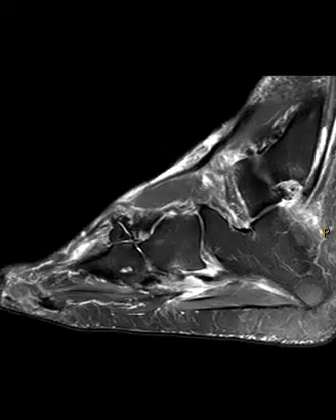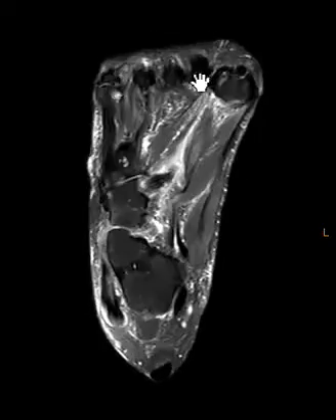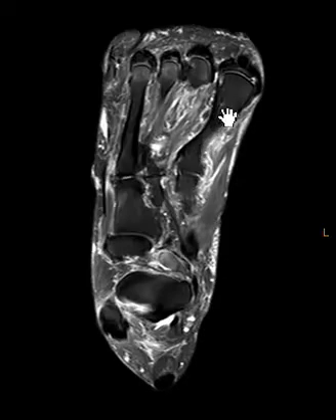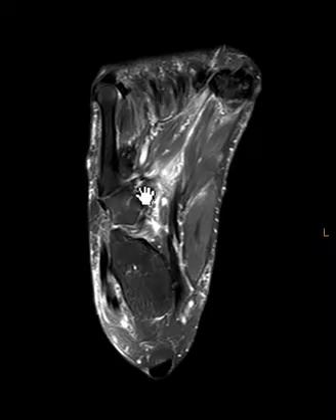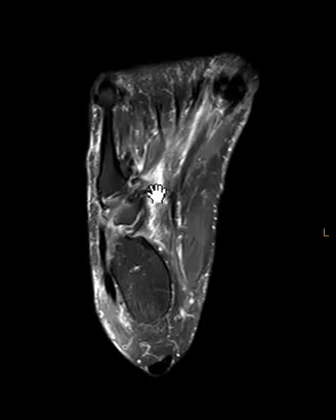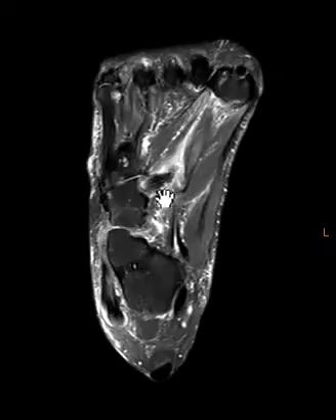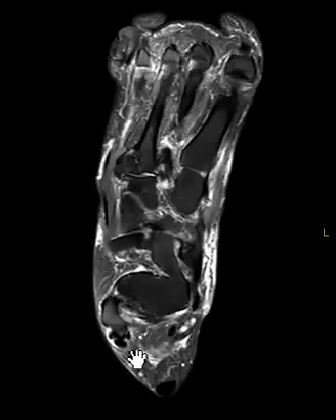We can see this on another view. This view shows the first through fifth metatarsals, and remember the peroneus longus is going to attach here — insert on the base of the first metatarsal. It's going to come sideways here. It looks irregular, with abnormal signal and ill-defined margins. And then in this region there's fluid between the longitudinal fibers — confirming this partial tear of the peroneus longus tendon. It wraps around here and then comes up on the lateral side.